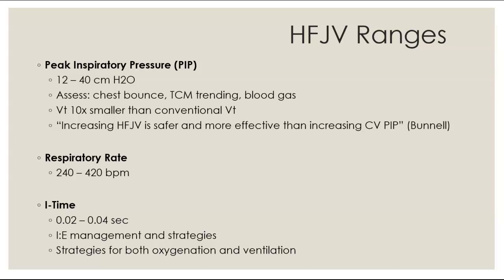If you decide to adjust the respiratory rate, you have to go by jumps of 20 to 40 to have any type of change. This isn't like I'm going to go from 420 to 415. No, you need to do leaps of between 20 and 40 to actually have considerable differences with your respiratory rate. So how I talk about big bites and little bites with CO2 management. PIP, little changes make big bites. Respiratory rate, big bites make little changes.